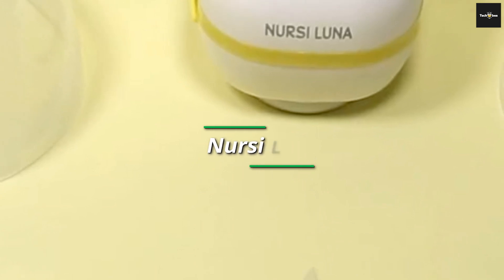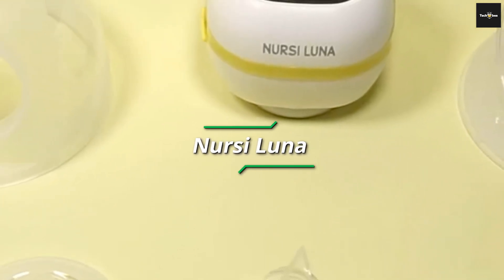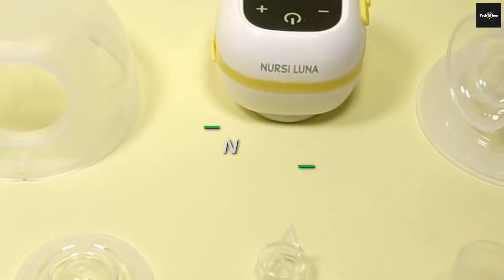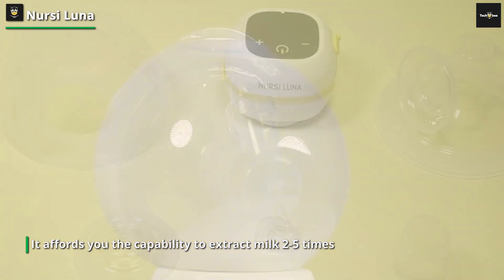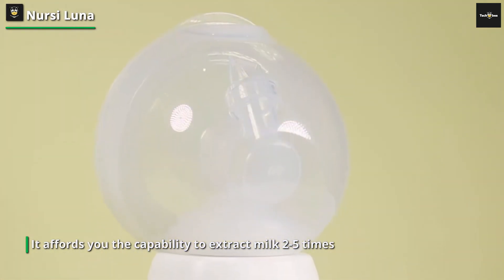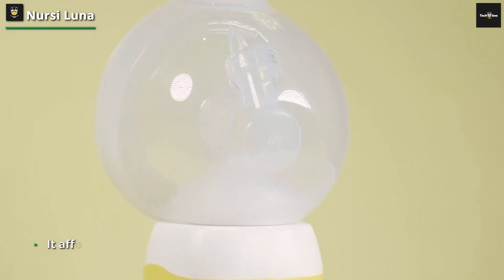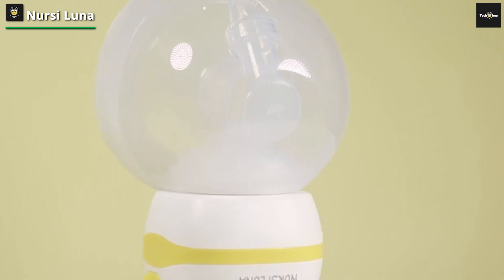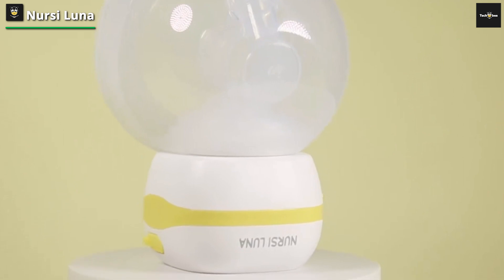Nursi Luna. This hands-free dual breast pump facilitates the expression of milk while seamlessly integrating into your daily pursuits, thereby economizing your time. It proves to be an excellent companion for use within your home, corporate environment, or during journeys. On a single charge, it affords you the capability to extract milk 2.5 times, amassing a voluminous 180ml reservoir of nourishment.